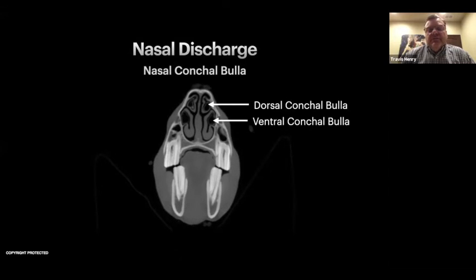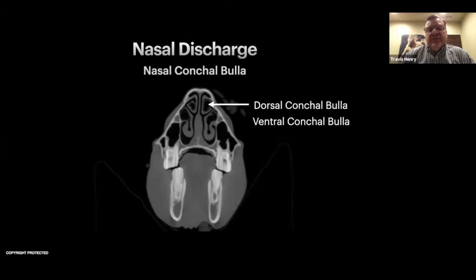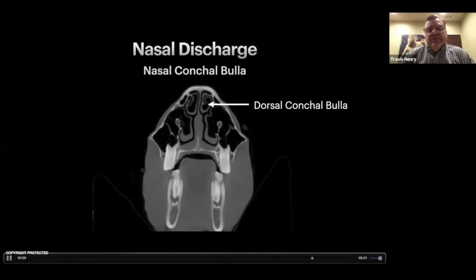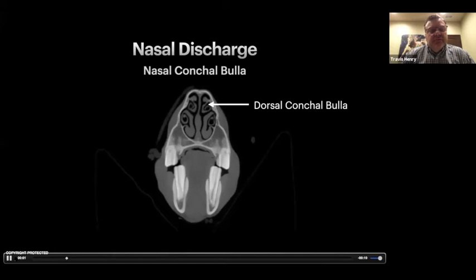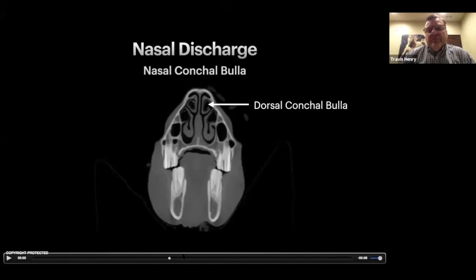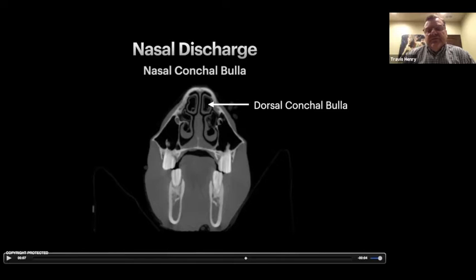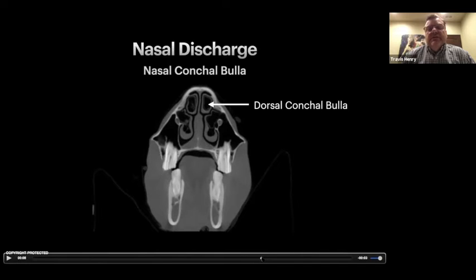And if you follow this, you're going to see the sinus come into view here, and the dorsal one is going to keep going. So here's our sinus, and then our dorsal kept going. Just pause this and we can run back there quick and show you kind of where that all starts to come into play. So right here, we start to lose the ventral conchal bulla. We can start to see the sinus infraorbital canal. So it's starting to end here, and then we're going to start to see sinus, and the dorsal is continuing here as it actually runs back a little bit farther than the ventral one, if the horse has read the anatomy book.